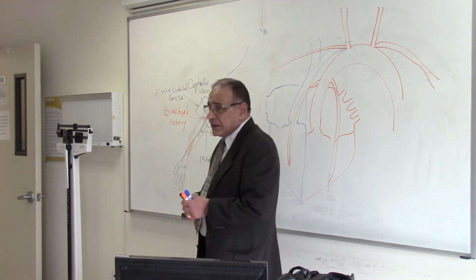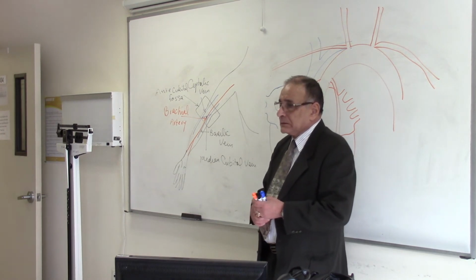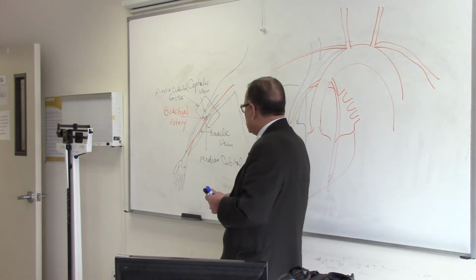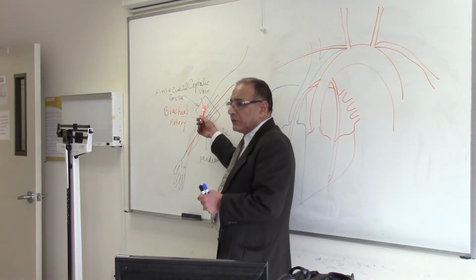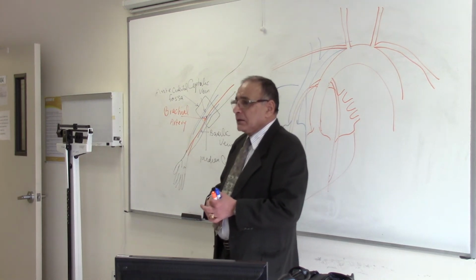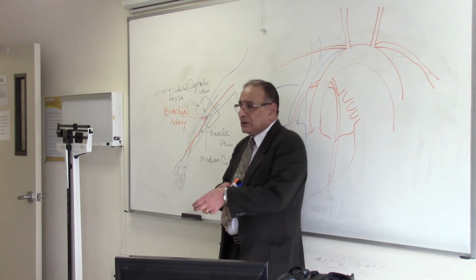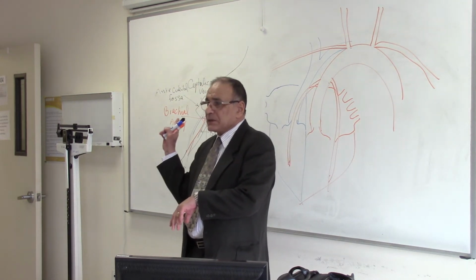Sometimes you find these veins are hard to find. Not every patient has the same appearance or the same size of vein. Are you allowed to take blood from a different area? Yeah. The answer is yes. Where? Which vein? You can choose the wrist, or the dorsum of the hand. But this is the first choice.